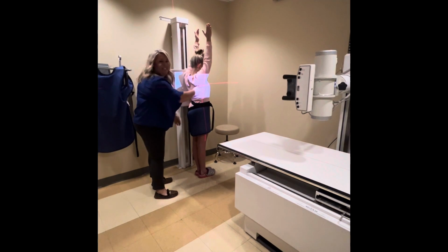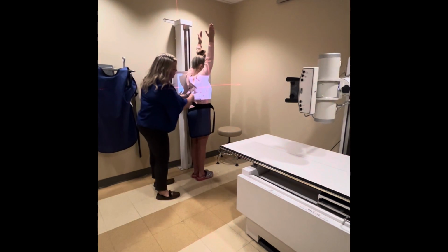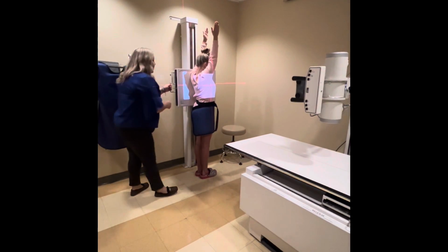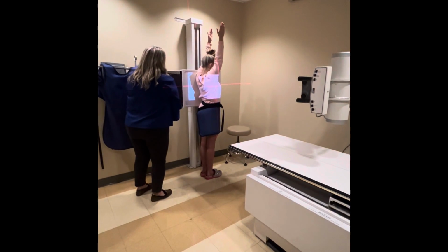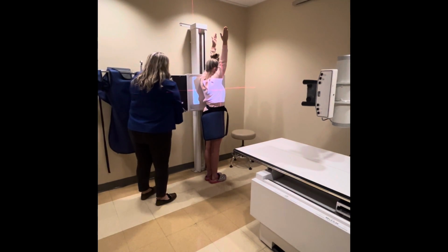And we can see that this isn't exactly lined up to the midline of her body. So I'm going to have her scoot back just a little bit. Very good. So we're midline to the body. She's good and straight. One thing that we need to make sure that we do is change the orientation of our cassette. So now we're going to go from crosswise to lengthwise. We're still at 14 by 17.